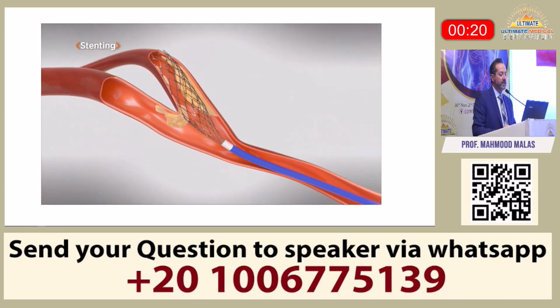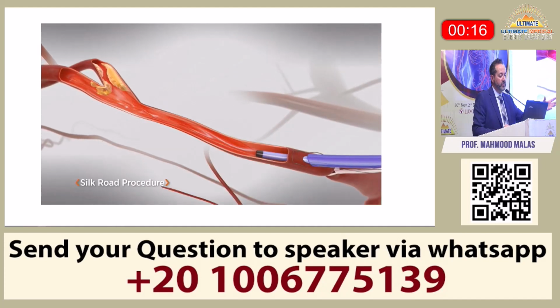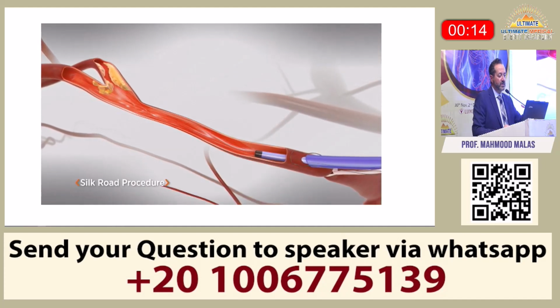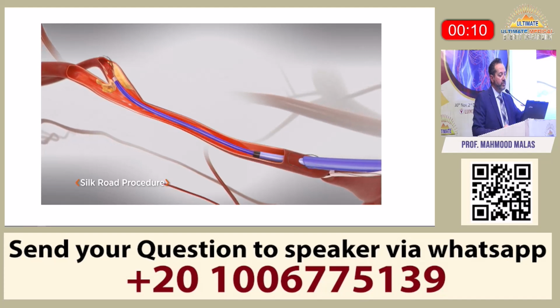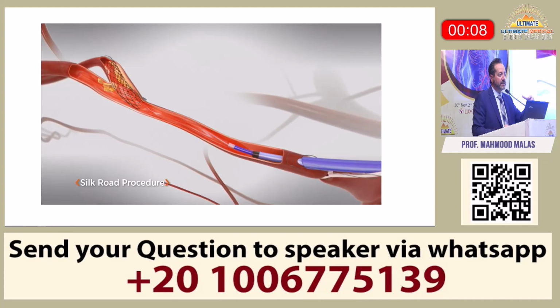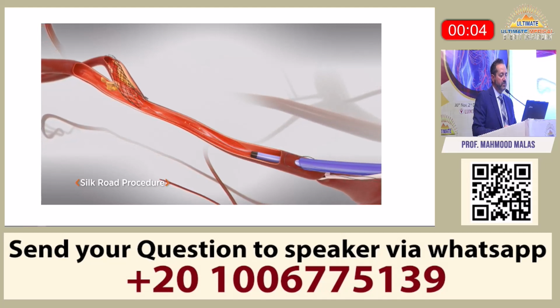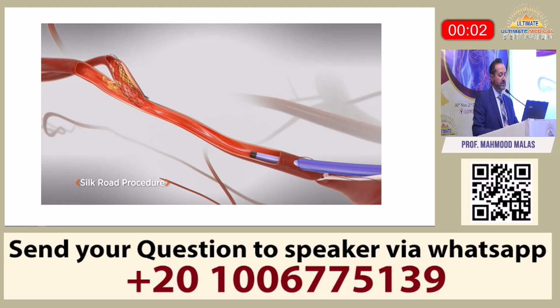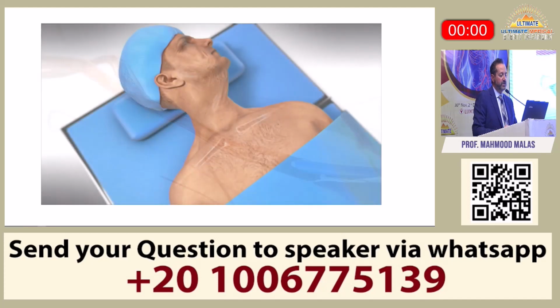So you put the distal embolic protection and you put the stent, but embolization can happen. Now notice how the flow is gonna reverse, and the debris, instead of going up to the brain, is gonna go back through the sheath. And essentially, that's the whole concept of TCAR. And you'll see why this happened, because you have the arterial sheath, and then essentially you have a venous sheath.